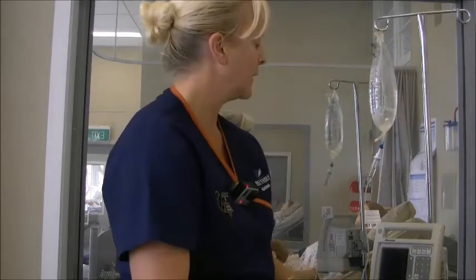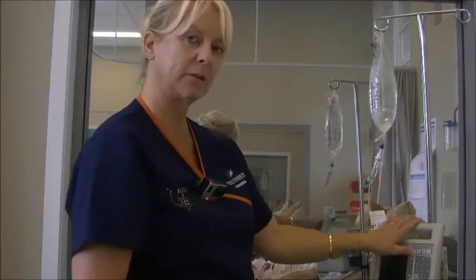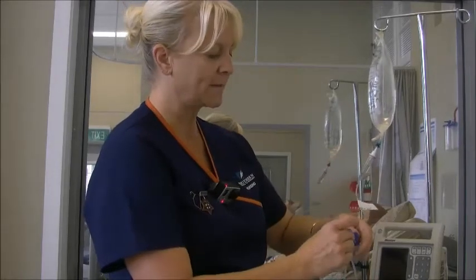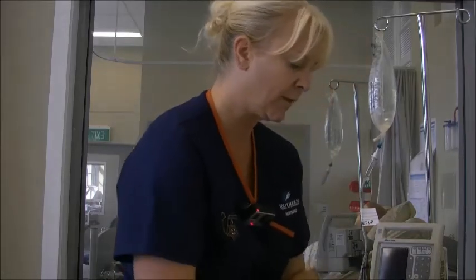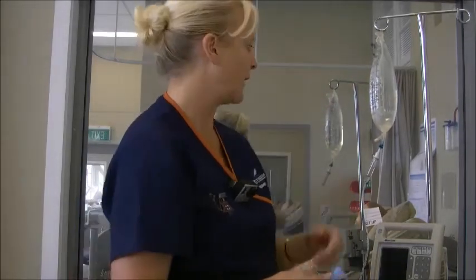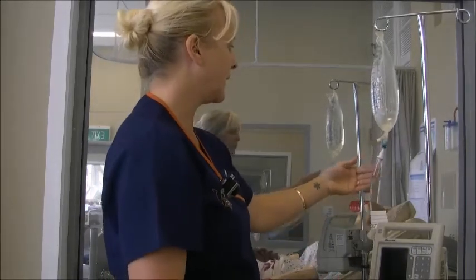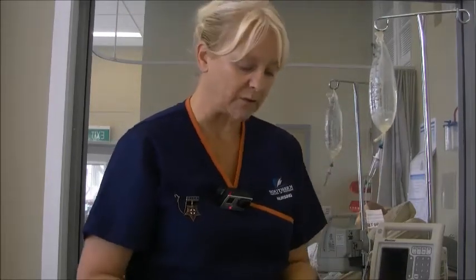Okay. So what I want to do firstly is do a manual check. So I'm going to make sure that I haven't connected it through the IV pump yet. So I'm going to make sure that everything's open. So all my clamps are off. And the clamp down here is off. And then I'm going to use the roller clamp to count the drip rate. So what you need to bring along is your fob watch and make sure that you've calculated the rate that you want to deliver over a minute, so drops per minute, and then you're going to do a manual. So while you're doing that, you'll be adjusting the roller clamp and counting at the same time. So make sure you do that for about a minute. Once you've done that, then you need to connect it through the machine.